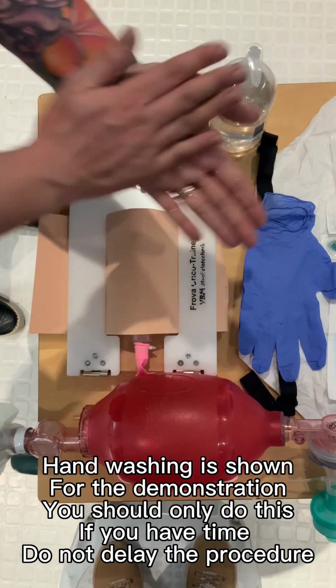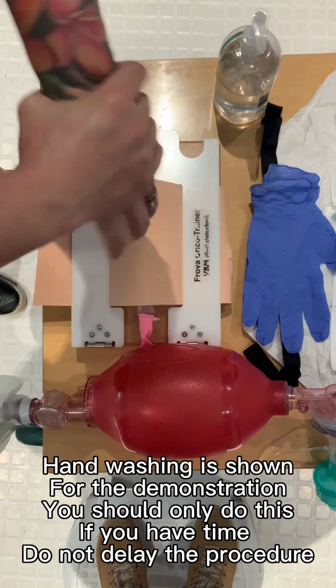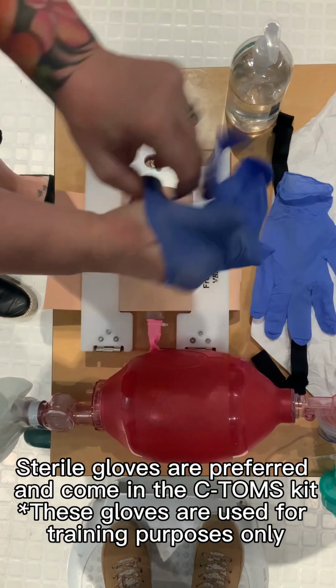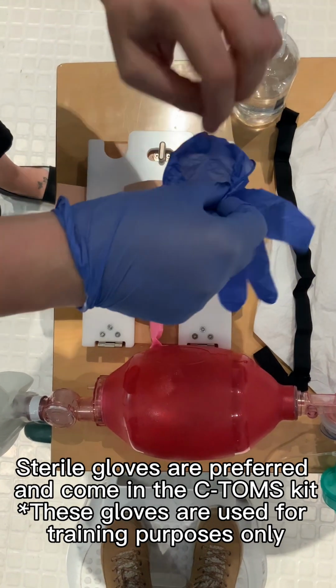Handwashing is shown for the demonstration. You should only do this if you have time. You should not delay the procedure for handwashing. Sterile gloves are preferred and come in the CTOMS kit. These gloves in the demonstration are used for training purposes only.